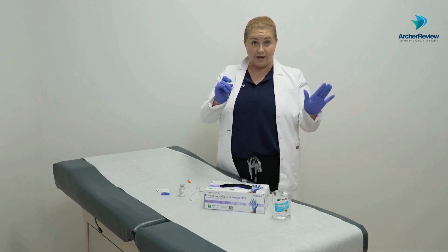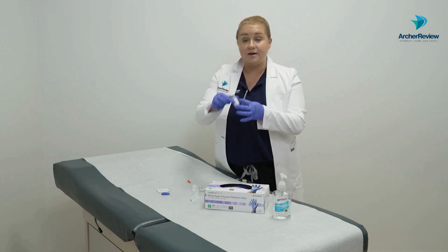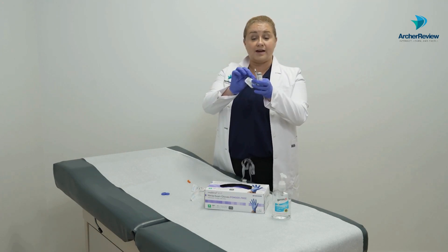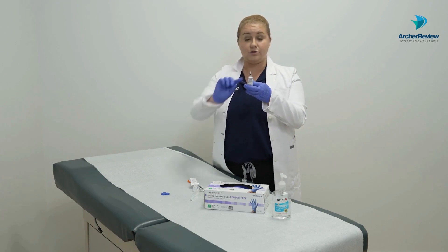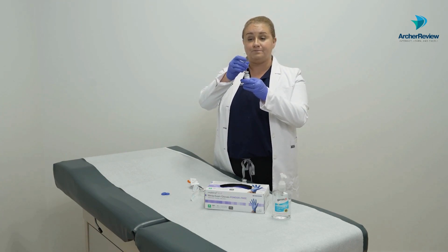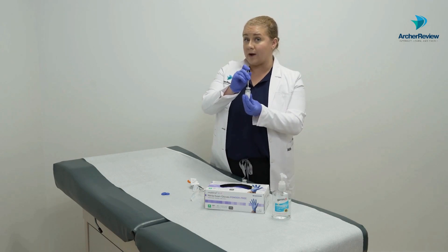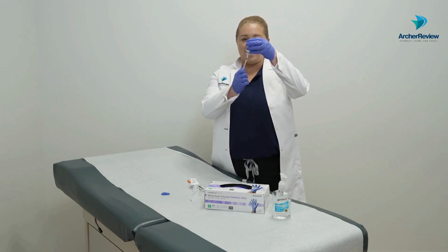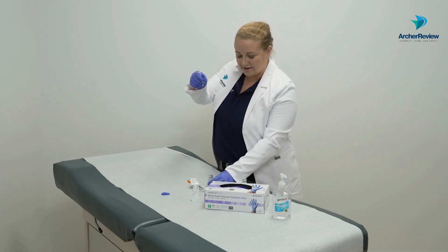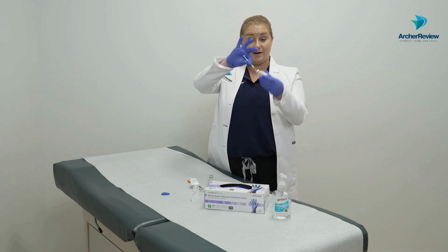Now we need to take five units of air for the regular insulin and inject it into that vial. That's where our second alcohol prep pad comes in. We scrub and let it dry, then inject that five units of air. Now that air has been injected into both vials, we can draw up in the correct order: regular first, then NPH. We flip the regular vial over and draw up five units, then draw up two units of NPH. We're ready to go.